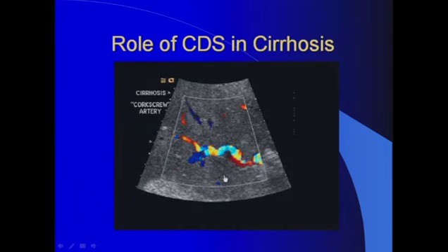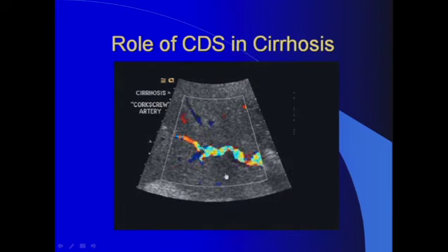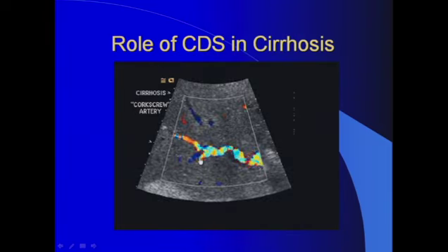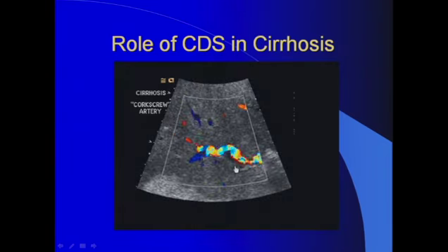This is a very good sign to suggest that there is some disruption to the portal flow to the liver, because even though you can see everything is still flowing in the right direction in the portal vein nearby, this large artery suggests that not enough portal blood is going into the liver. You can notice how sluggish the flow is in the portal vein adjacent to the artery.